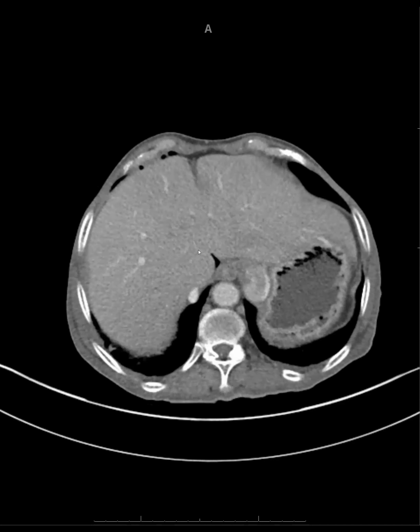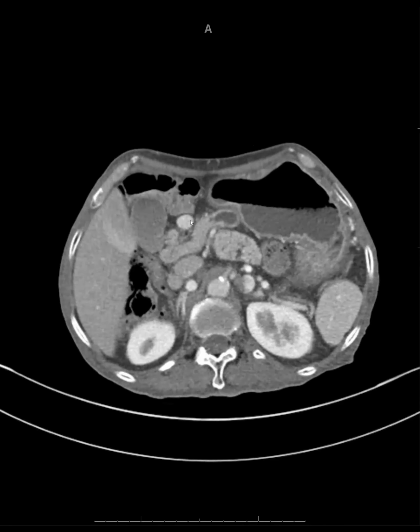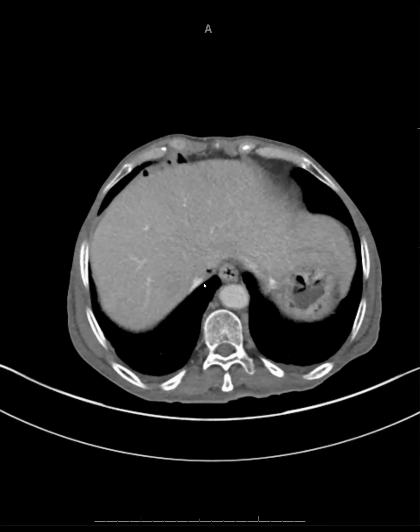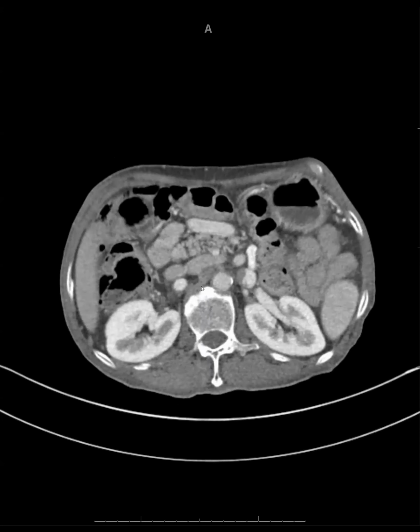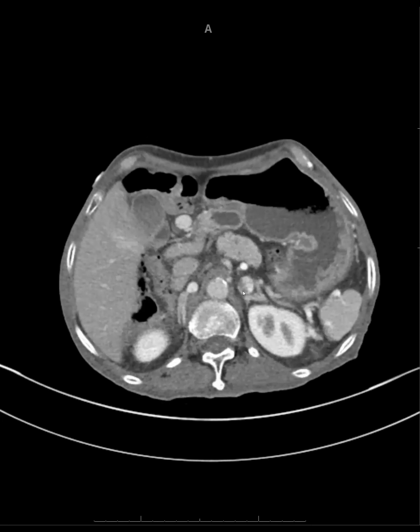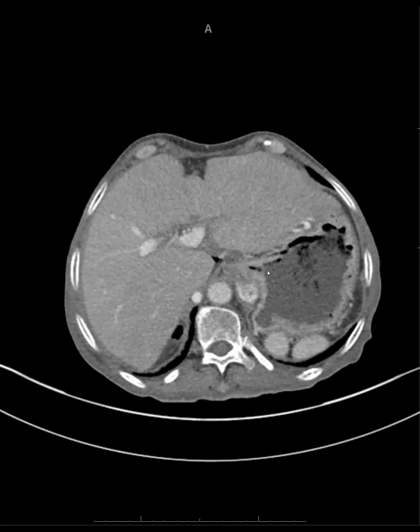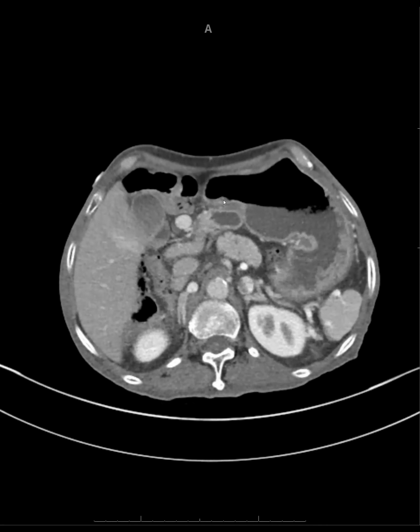Here, the midline-ish liver with the pre-duodenal portal vein and a left IVC. Here we have the right IVC coming down and ending in the renal vein, and the left IVC coming around here and into the pelvis. Further, we have absence of the pancreatic tail and malrotation.